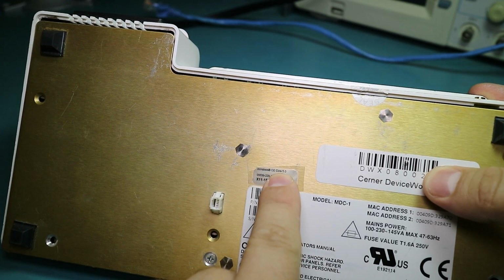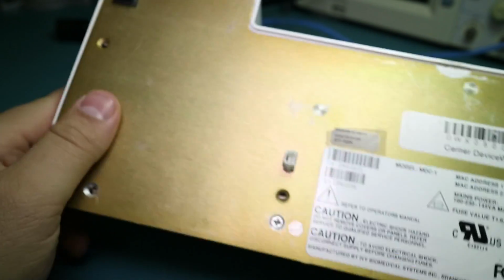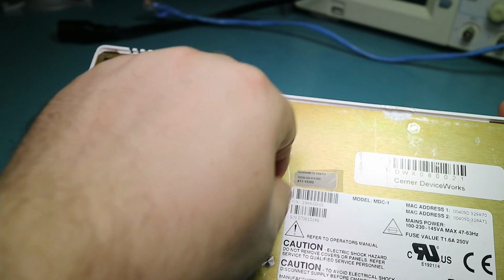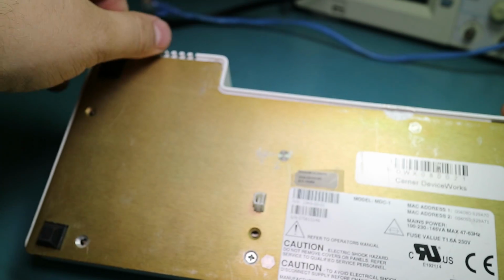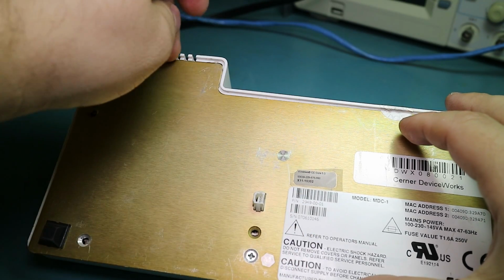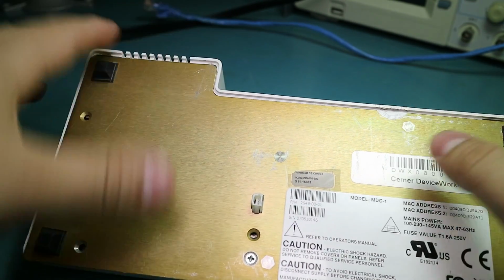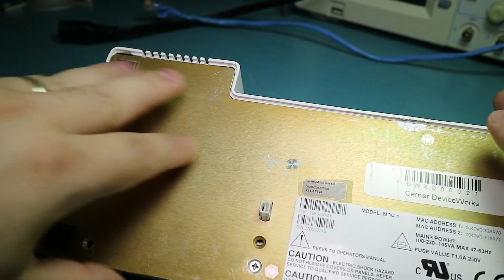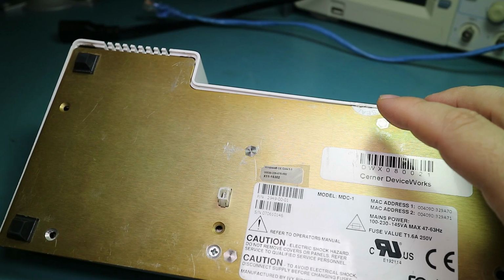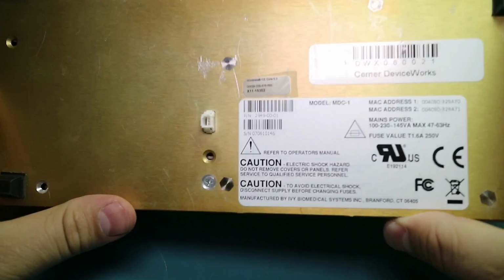This says Windows CE Core 5.0. That would be your little license sticker. And I've already taken out the screws. This screw is kind of a trick because it's actually connected to a ground lead. So you try to unscrew it and it just doesn't go anywhere because it's spinning a nut on the inside. So this case kind of comes apart. Oh, and it's actually made in Connecticut, USA.